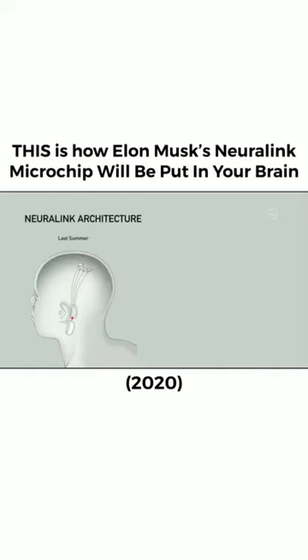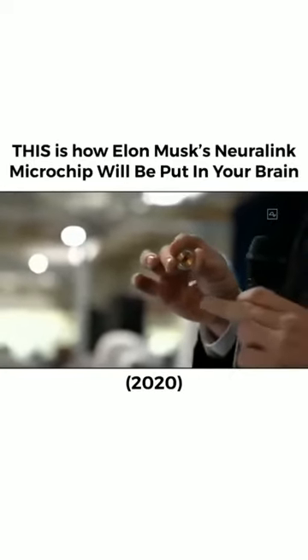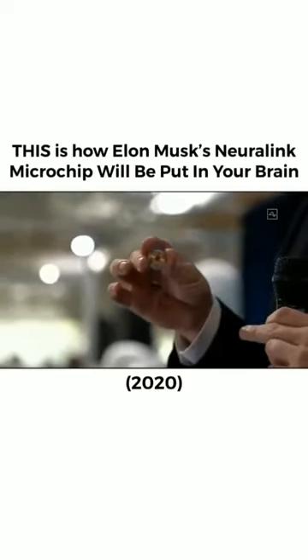So we've simplified this to simply something that is about the size of a large coin, and it goes in your skull, replaces a piece of skull, and the wires then connect within a few centimeters, or about an inch, away from the device. And this is sort of what it looks like. This is our little device. That thing at the bottom is just to hold the threads in place, because they're just like little fine wires.